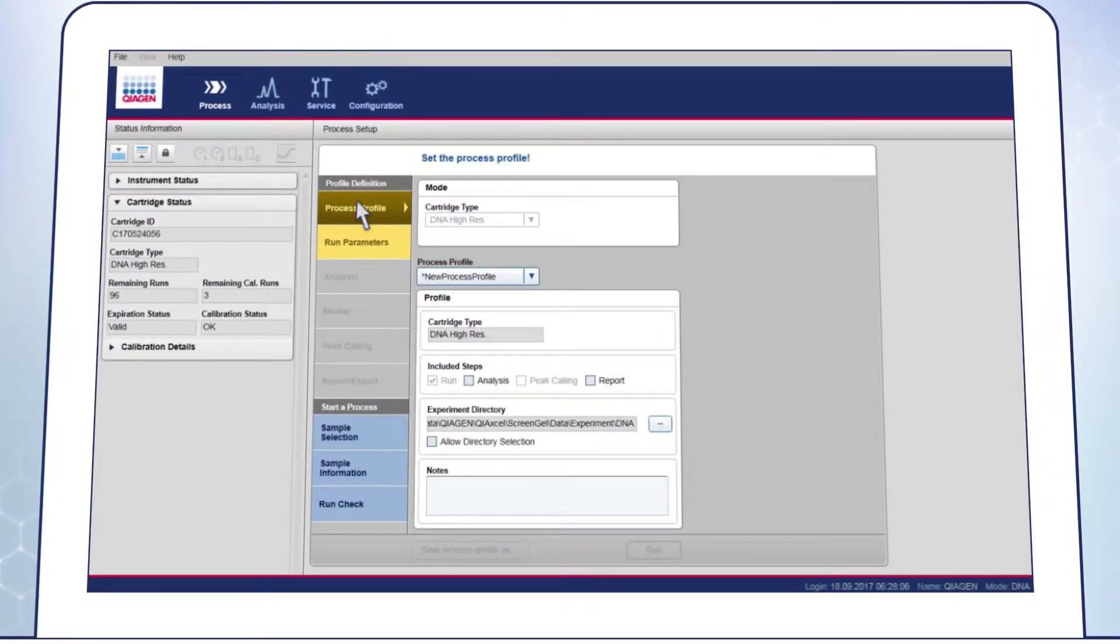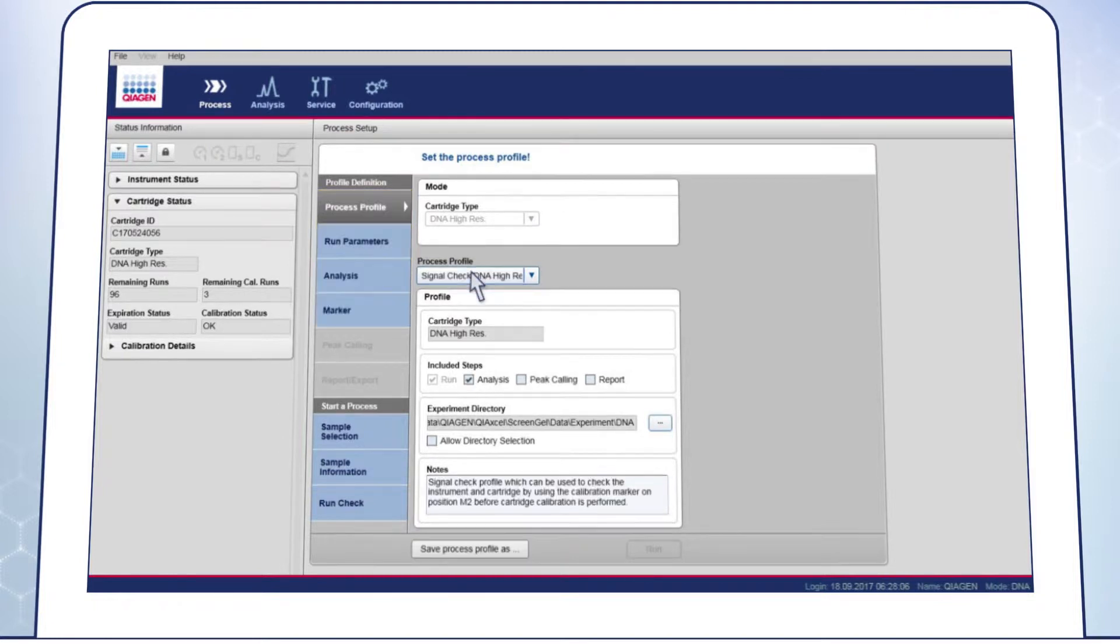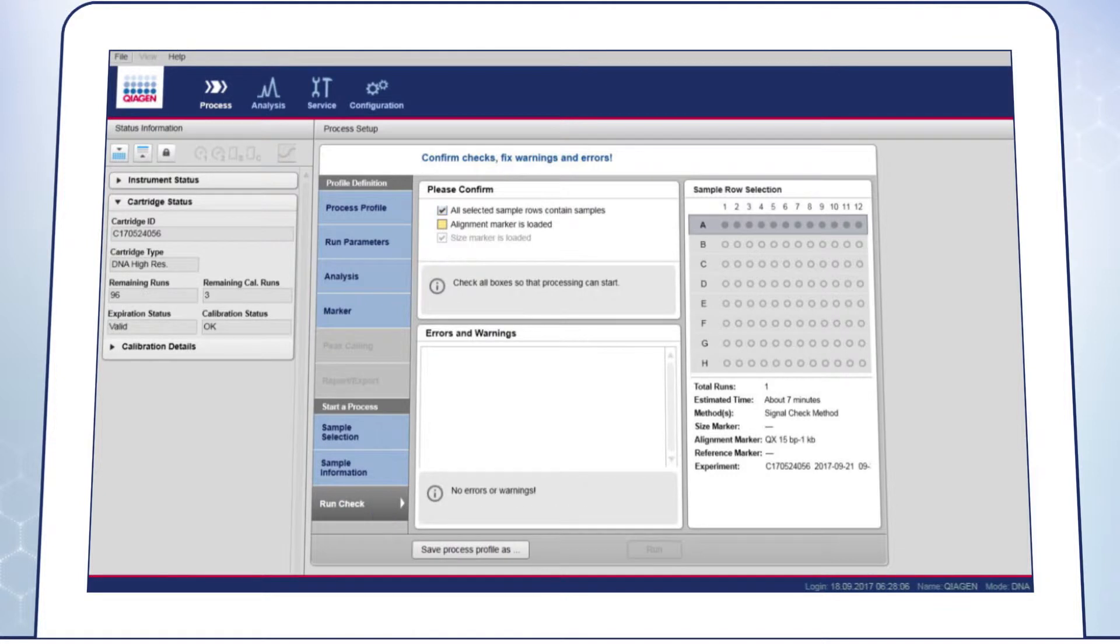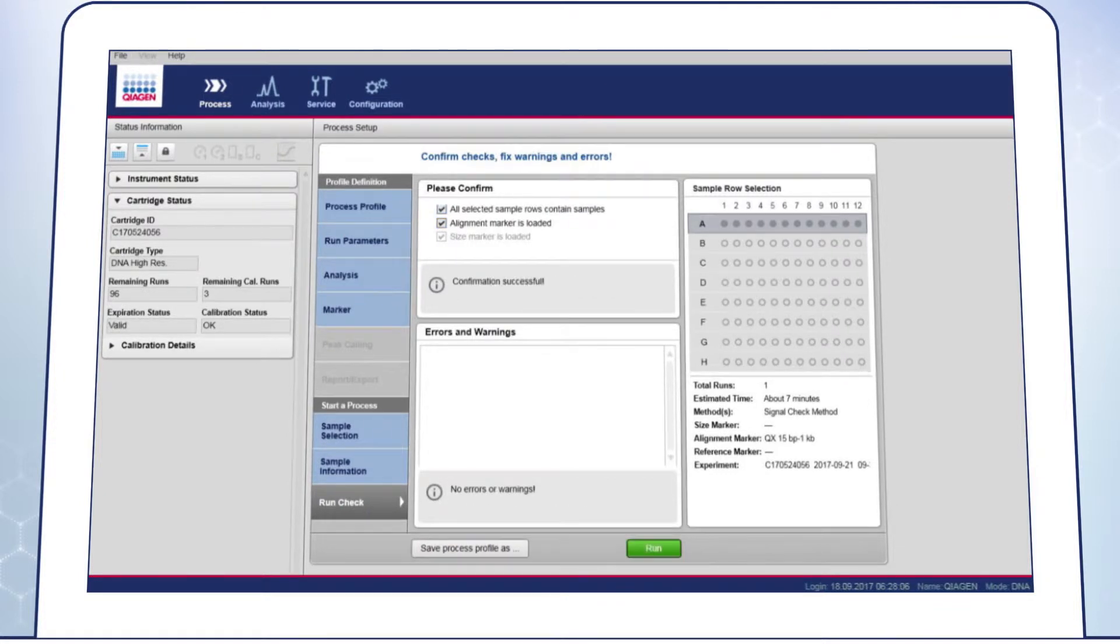Under the Process Profile tab, select the Cartridge Type and the default Signal Check Process Profile. Go to the Run Check screen, enter the required information and click on Start Run.